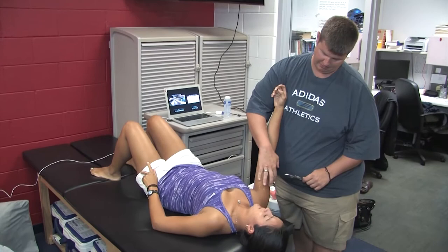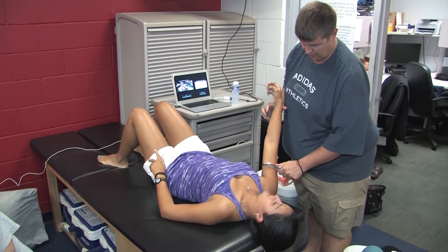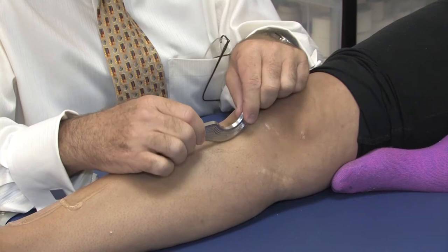A lot of our throwers end up getting some bicep pain or lateral bicep pain. We're going to have her come from flexion down to extended position, and we're just going to sweep right through. I can come through here and pivot through the tissue. I can use two hands, coming both ways.